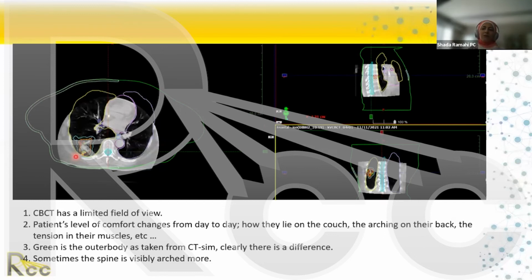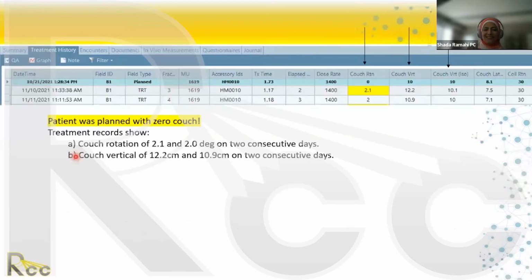And this would take probably several times back and forth until they get it right, because again it's clear we are missing a lot of data from the cone-beam CT. It's a very good question. So you put the patient on the table, everything looks good, and then you do your alignment.